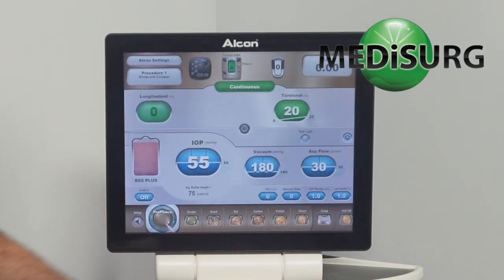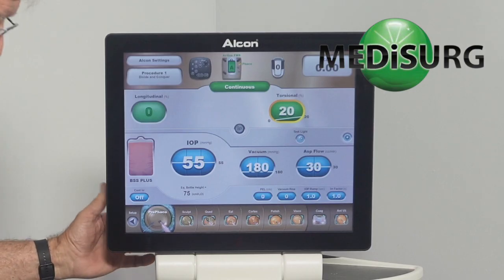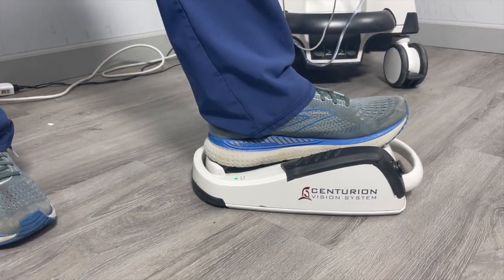So let's go back into surgery. I'm going to press the foot pedal — nothing's happening.